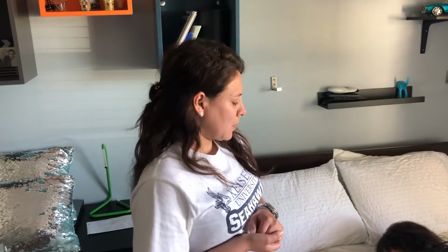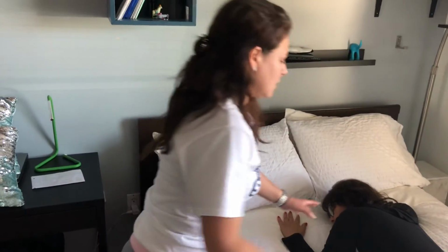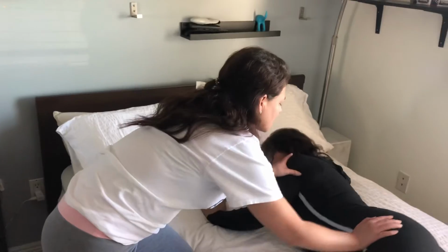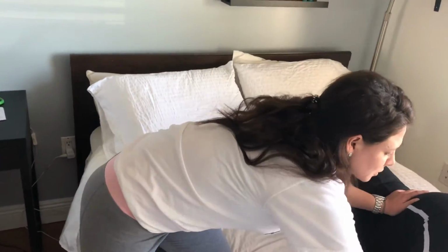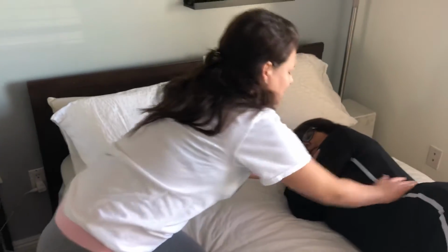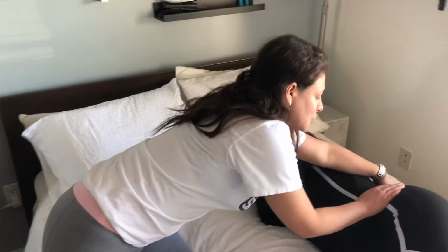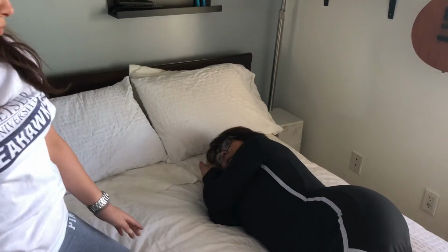Another position done in these exams are the left lateral decubitus and the right lateral decubitus. That is to see air levels. So if we do the left, since she's already in this position, I'm gonna do the right, in which she's gonna turn 90 degrees. Now you can put one on top of the other. We have to make sure that she's completely aligned and the femoral heads are completely superimposed.